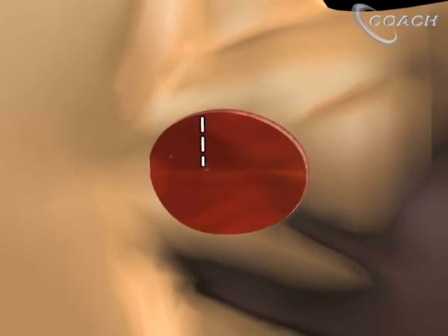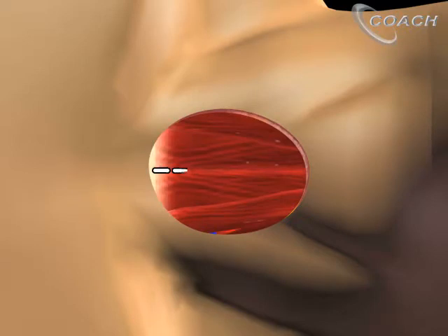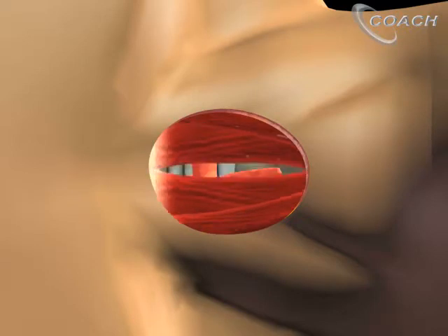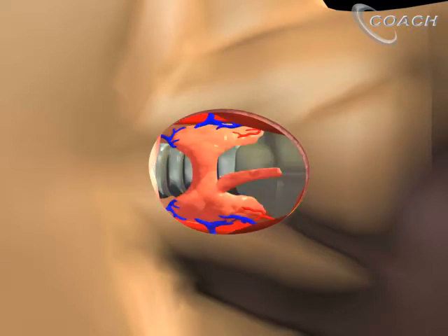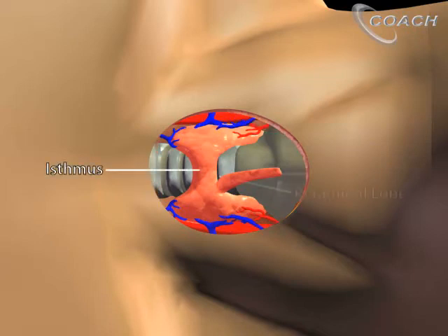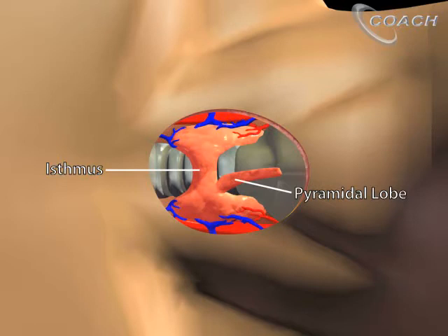Once we've made our skin incision, we divide the platysma and then we'll divide the strap muscles in the midline to expose the isthmus of the thyroid. Here you can see the isthmus, the pyramidal lobe — which is only present in about 30% of patients — and the location of the delphian lymph node, or the pre-laryngeal lymph node.